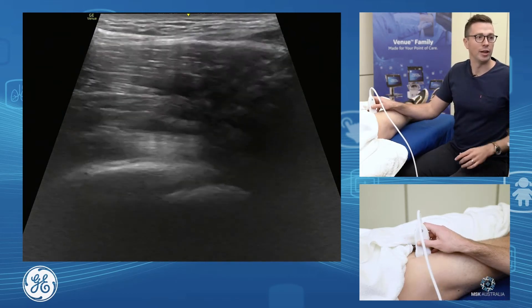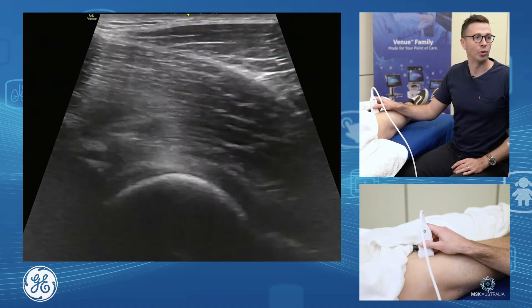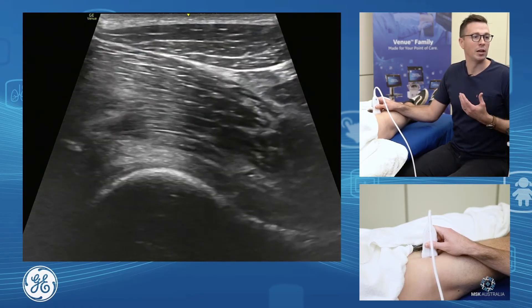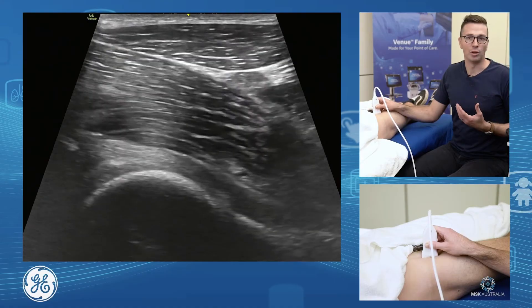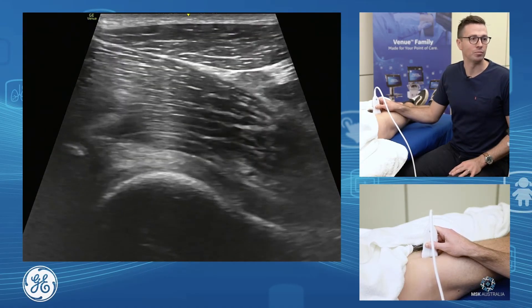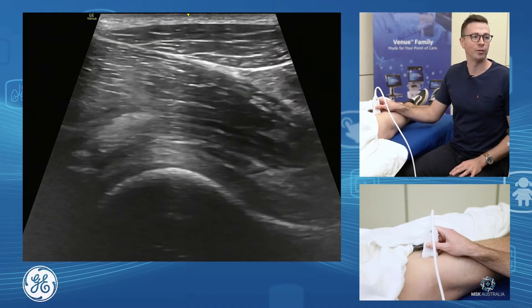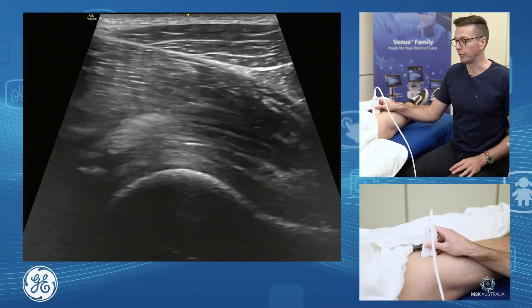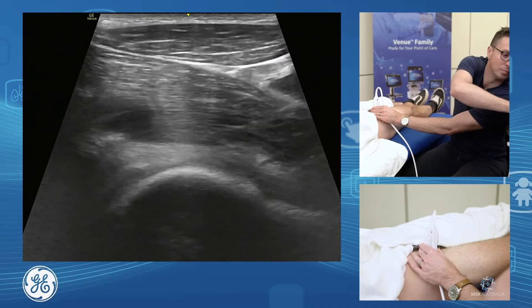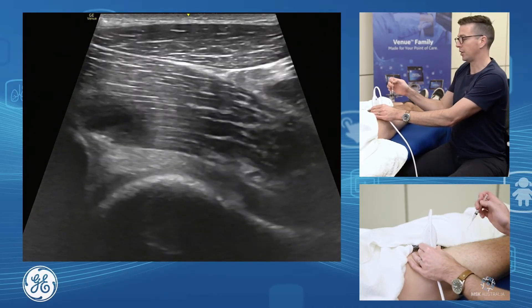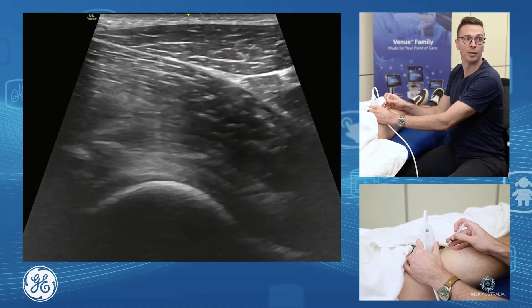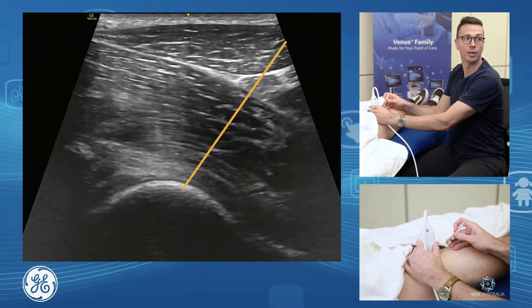If we were to do an anterior hip injection or aspiration — if you had an effusion and wanted to see what was happening, what the fluid contents were, if it's a query infection, or if you're looking at injecting the hip joint itself — I like a longitudinal approach on the hip joint. So I like to come in longitudinal and bring my needle down from an inferior aspect.